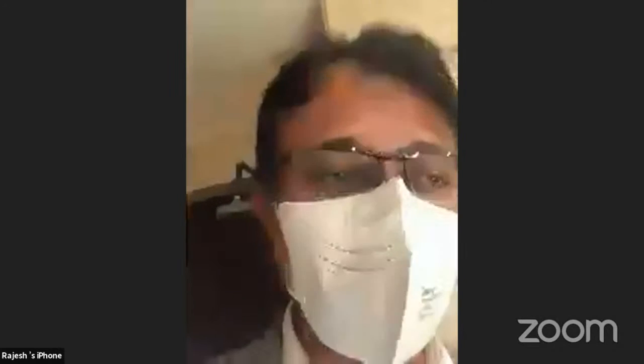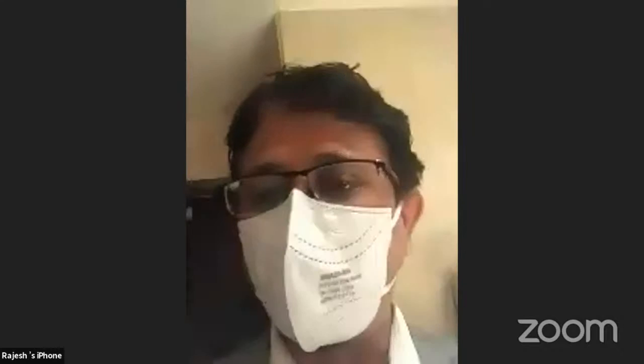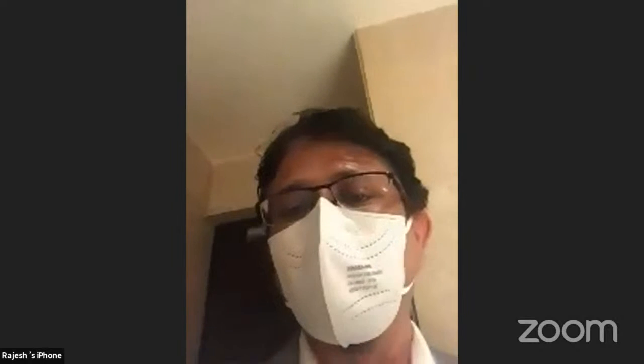Rajesh Sinha, can you tell us what would be its role in lamellar keratoplasty? Intraop OCT? IOCT? Yes. Actually, in lamellar keratoplasty, IOCT is really very useful. For a posterior lamellar keratoplasty, let me first tell you, when you do a DSEK procedure, when you have implanted the lenticule and injected air, you get to know whether fluid is there between the donor lenticule and the cornea or not. If there's no fluid, that's the end point. You don't have to inject more air and wait for some time, and you can reduce the amount of air.